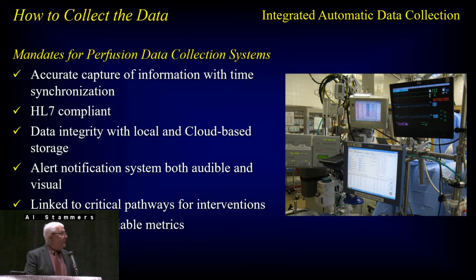So one of the reasons that we do the integrated automatic data systems is they accurately capture the information: HL7 compliant, data integrity, cloud-based storage, alert notifications. These are the mandates, and if you read any of the product literature they have, they describe that.